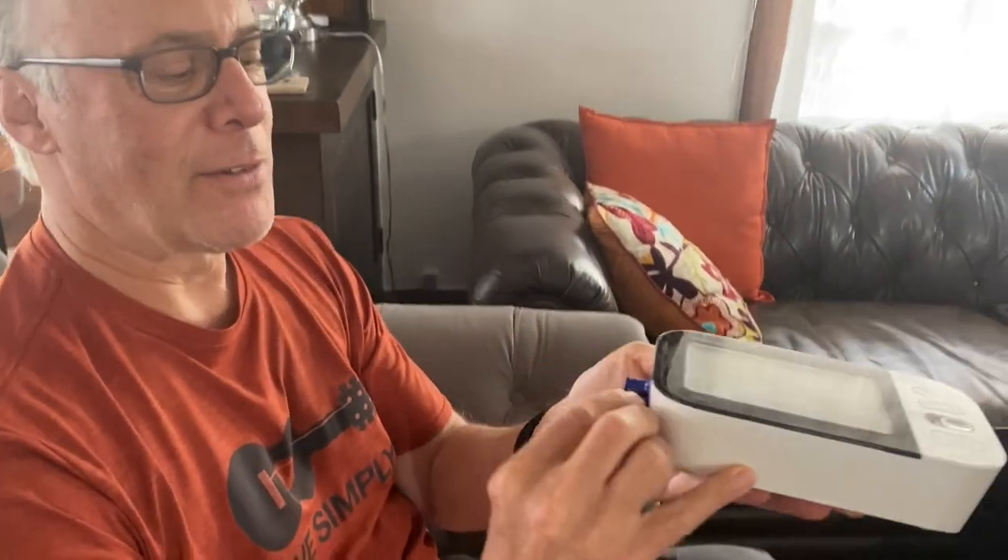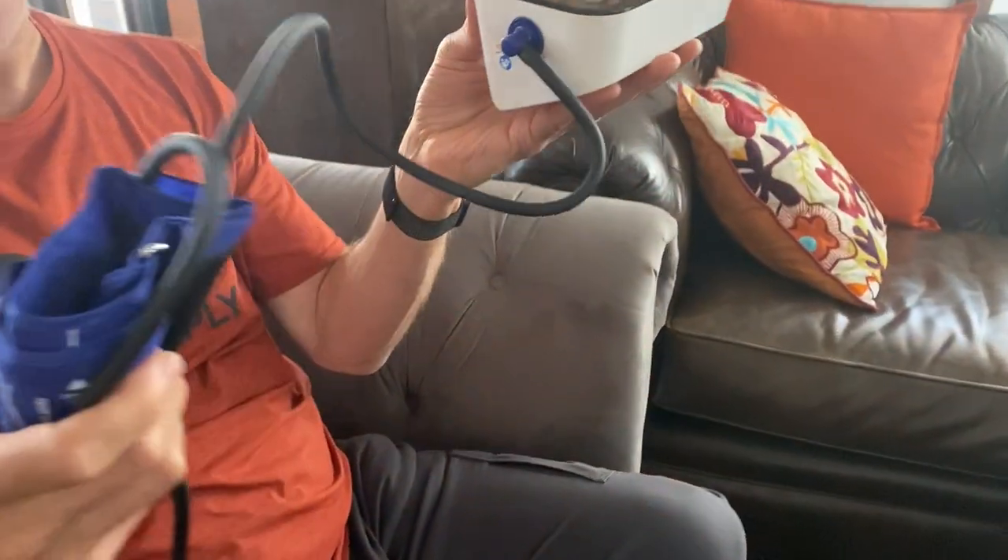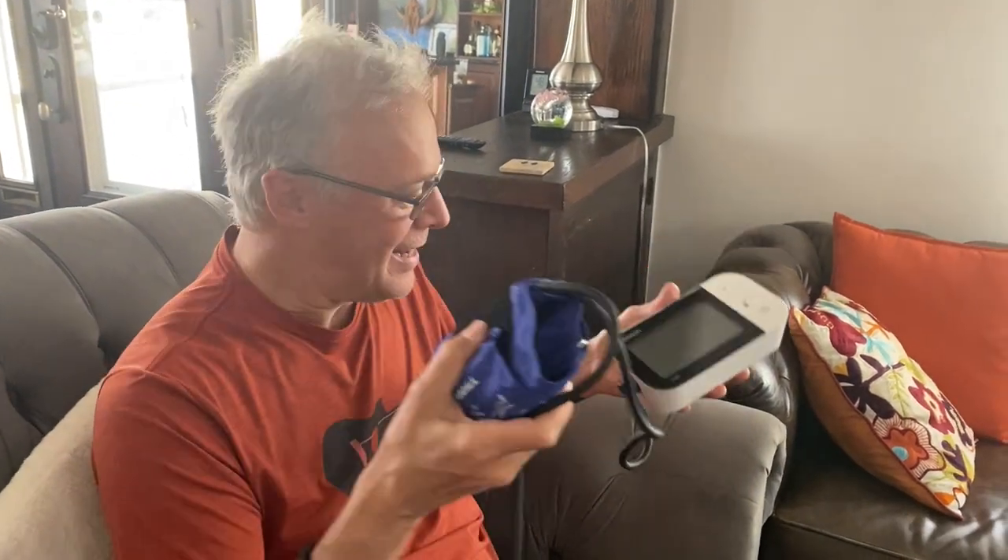Here's the cuff that comes from Walgreens. I'm going to take the bulb off because I'm not going to inflate this manually. I'm going to let my Omron machine inflate this cuff. So take the bulb off and put it aside — save it in case you ever need it. Just take the empty side of the tubing and plug it into your Omron machine where the cuff used to be, just like that. So now with my Omron, I have just my Walgreens cuff and gauge.